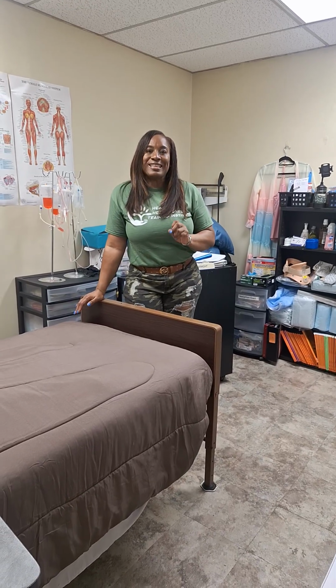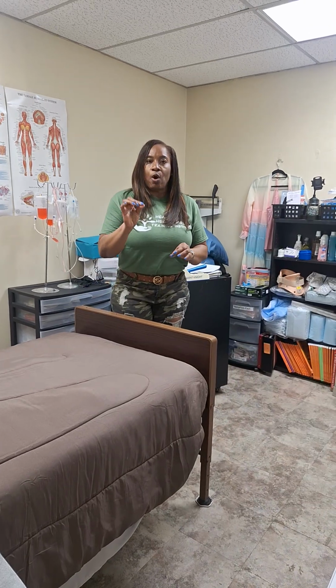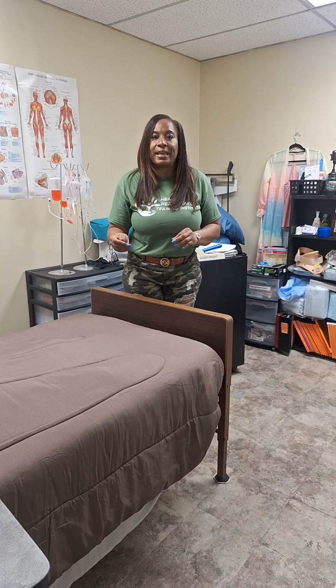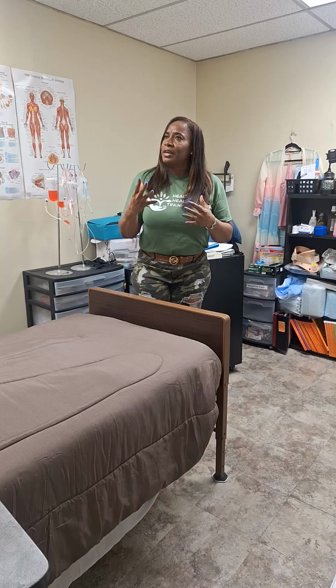The skill was catheter care. I washed the line, holding at the tip of the meatus, and I wiped 3 to 4 inches 3 times. I rinsed 3 times. I dried it. Once you do that, then you can say, I did everything.